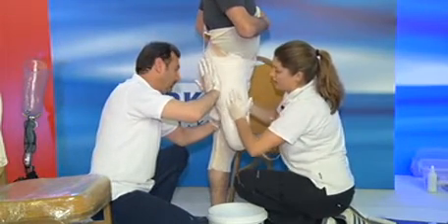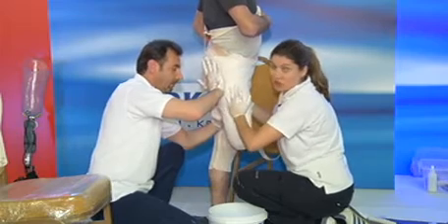Isaac's hand on the outside is just pushing into the subtrochanteric pocket.